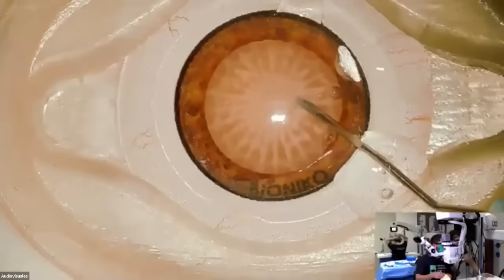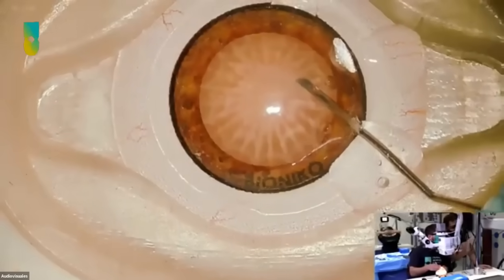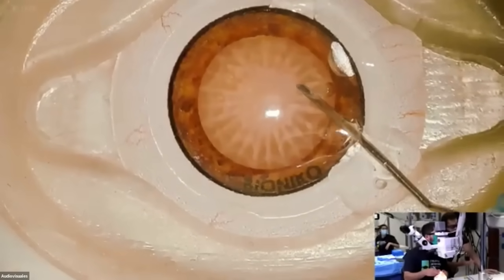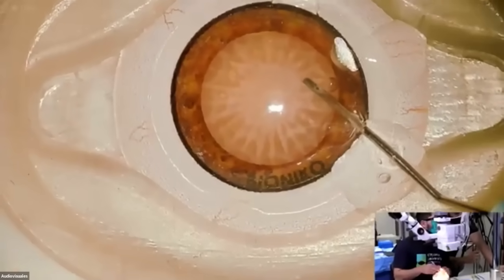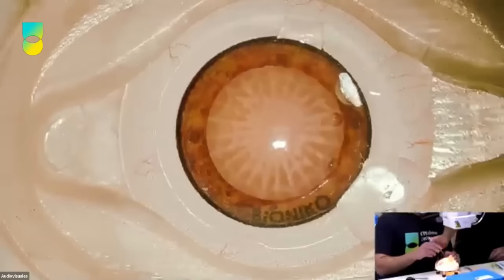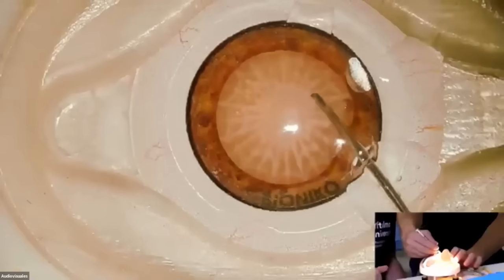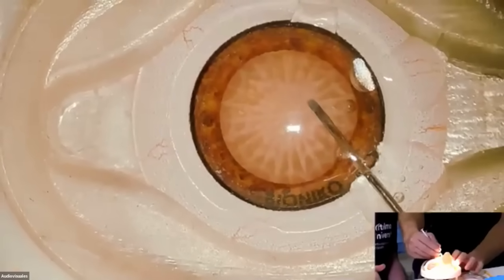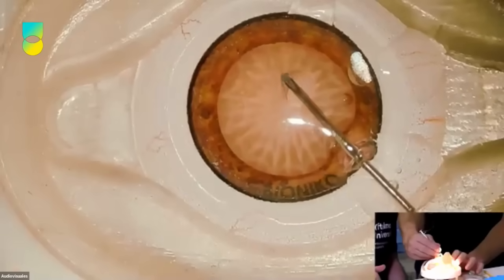The big thing when you're learning and you're following with the Rhexis is that you want to make sure that you have somewhere to re-grab. So I often tell the people that I'm teaching that you almost want to leave it like a sail, standing up so that you can go back and re-grab that sail. The last thing you want is to have the flap or the edge of the Capsulorhexis sitting flat and then trying to grab it and lift it up. So you want to make sure that you're standing it up before you reach around to re-grab, and that'll allow you to continue that motion where you're continually tearing in that circular motion to get it to come back towards you rather than trying to reach for it and find that edge.